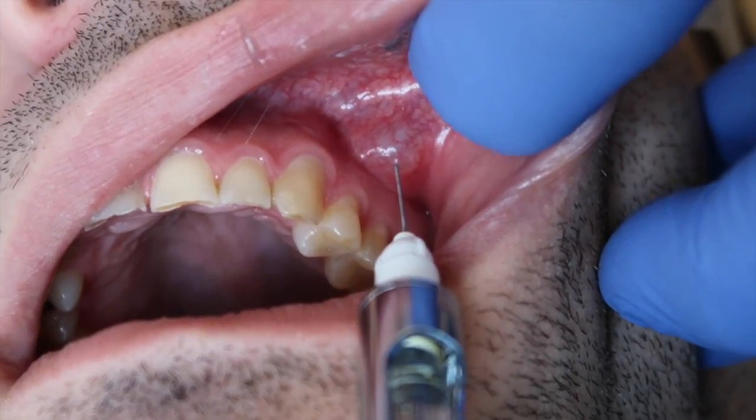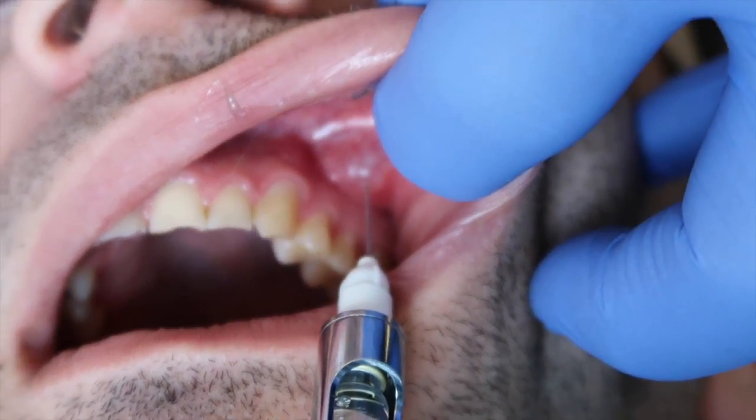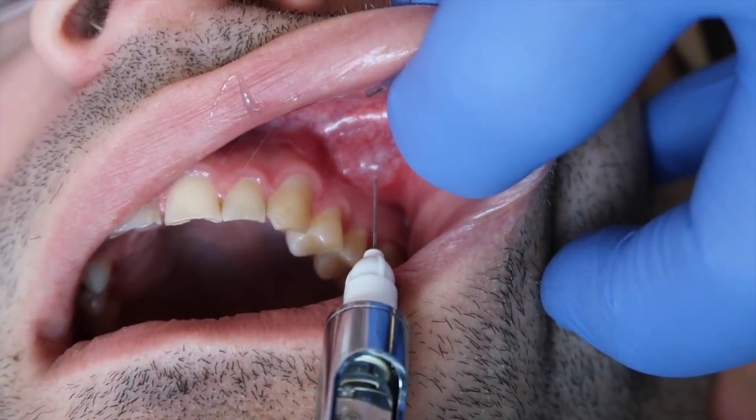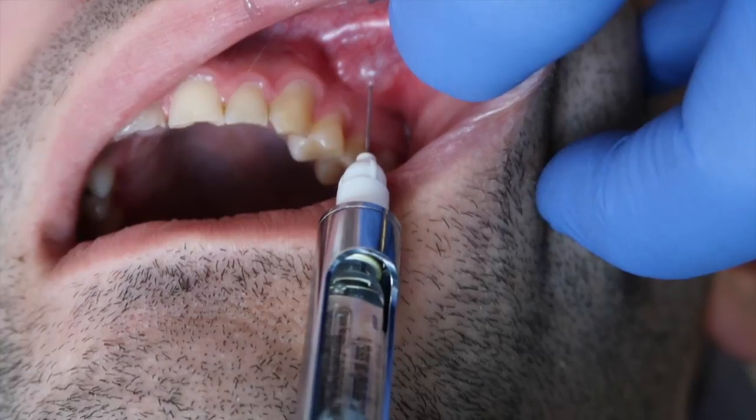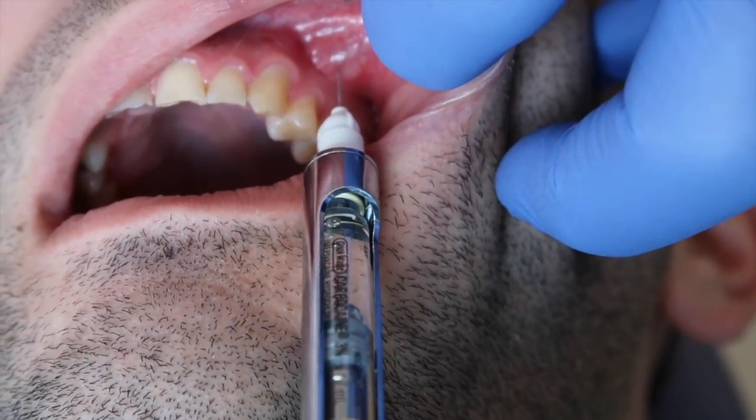I advanced the needle about a third of the way. Notice how slow this anesthesia is being administered. Now I can aspirate.